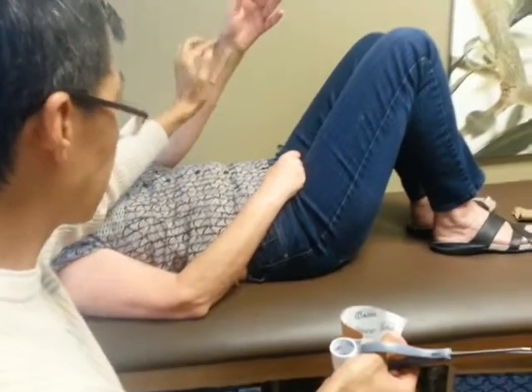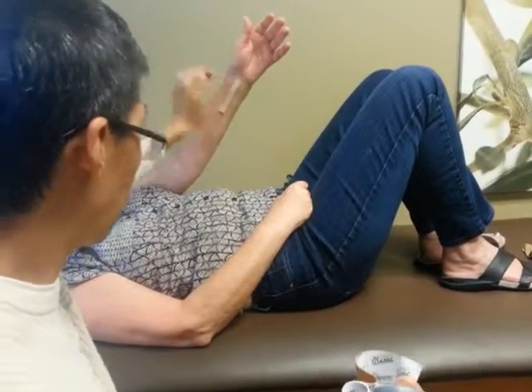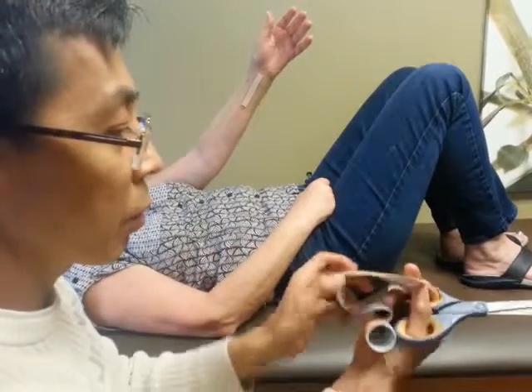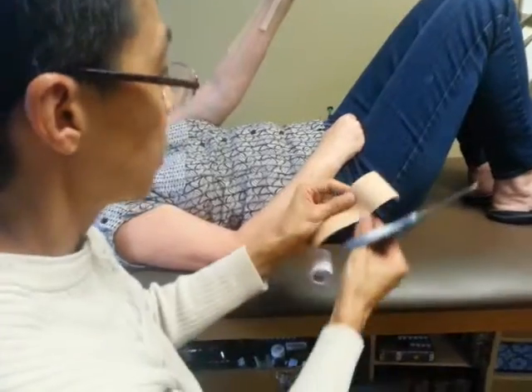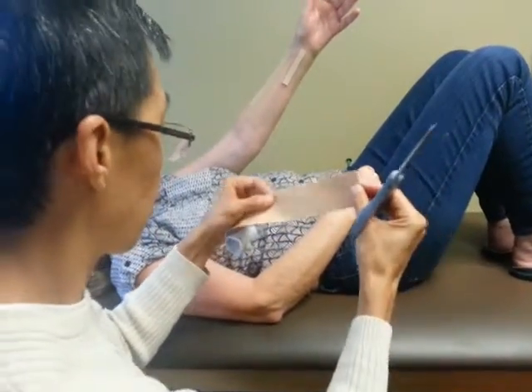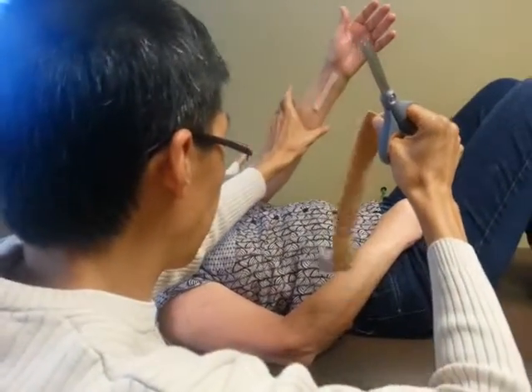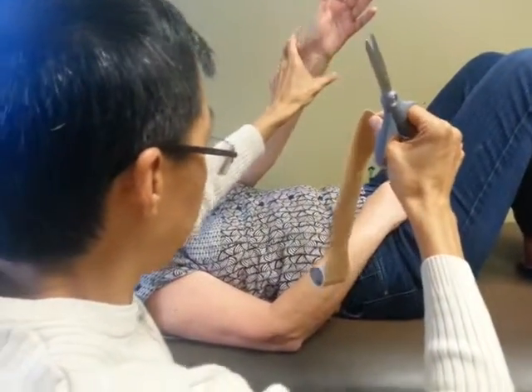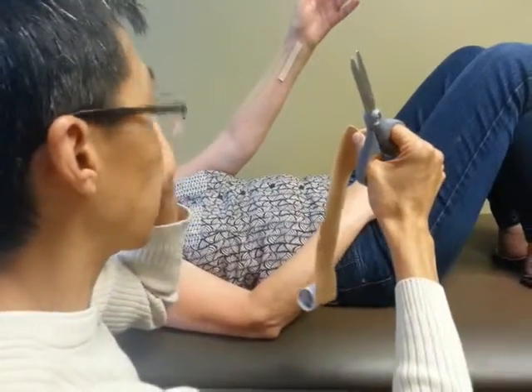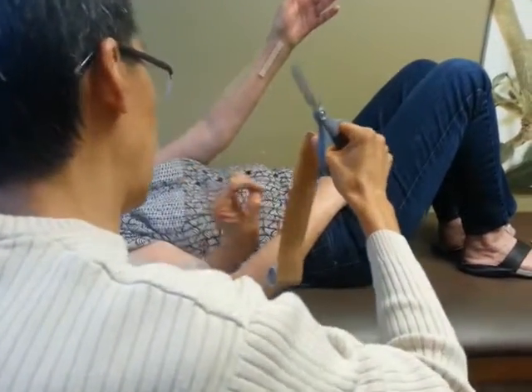I'm going to actually surround it because the inflammation is all the way around. I'm going to put one here, one here, one here, and one here with the full — I think this is a two-inch tape. The stretch is what gives it the pull, and the pull is what causes the fluid to dump out and reduce the swelling.